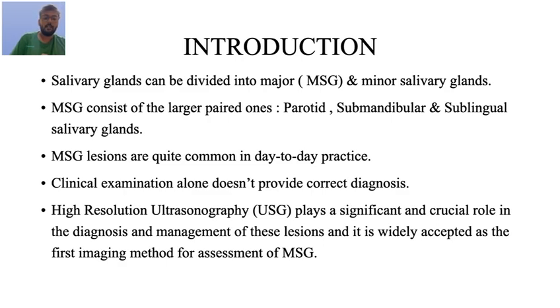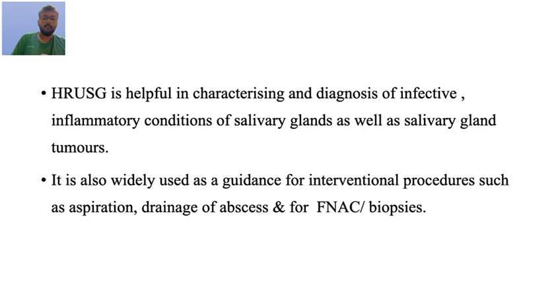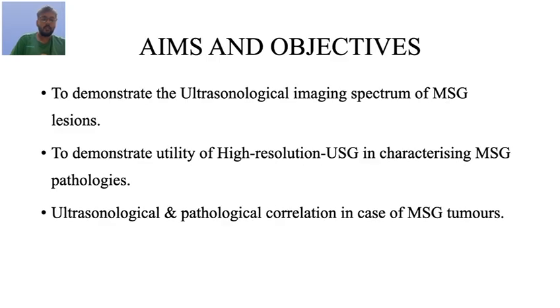High-resolution ultrasonography plays a significant and crucial role in the diagnosis and management of these lesions, and it is widely accepted as the first imaging method for assessment of a major salivary gland. It is helpful in characterizing and diagnosing infective inflammatory conditions of salivary glands as well as salivary gland tumors. It is also widely used as a guidance for interventional procedures such as aspiration, drainage of abscess, and for FNAC or biopsies.